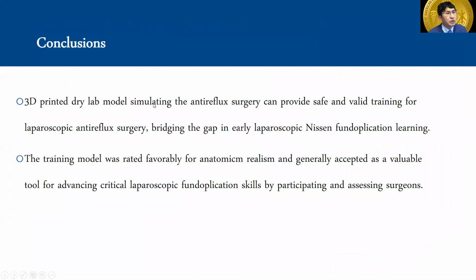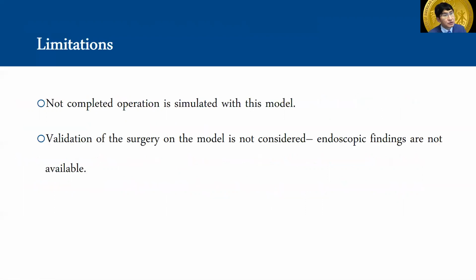So to conclude, the 3D printed dry lab model simulating anti-reflux surgery can provide safe and valid training for laparoscopic anti-reflux surgery, bridging the gap in early laparoscopic fundoplication learning. The training model is rated favorably for anatomic realism and generally accepted as a valuable tool for advancing critical laparoscopic fundoplication skills by participating and assessing surgeons.